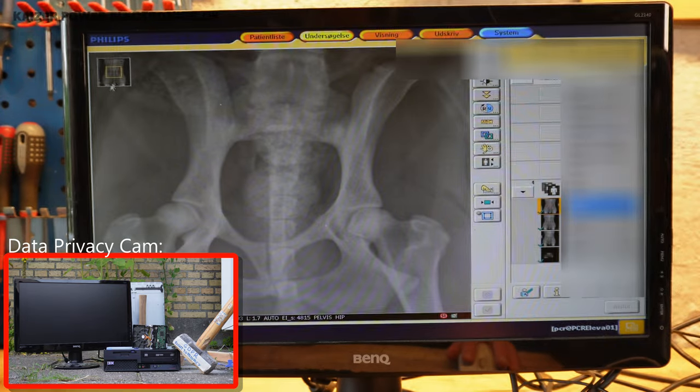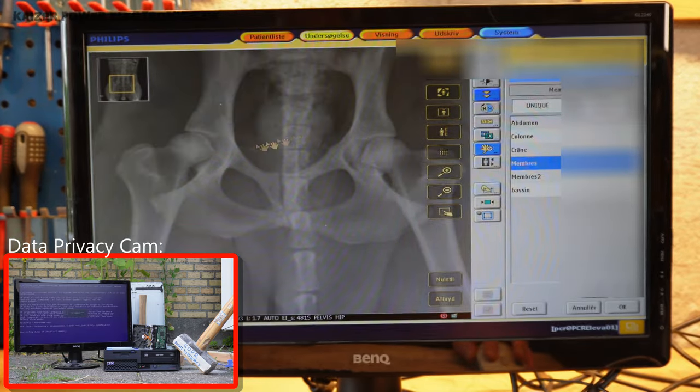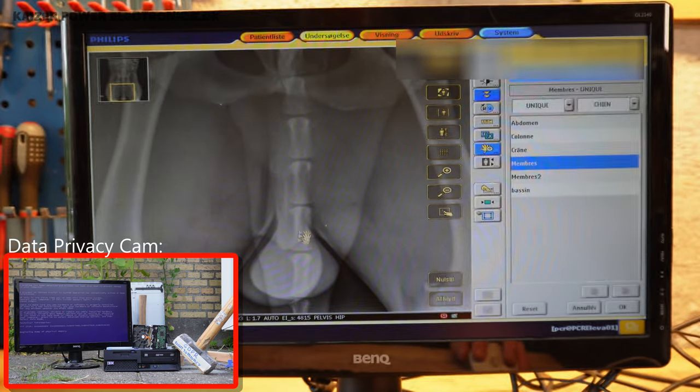Examination. Here we have something like drag and drop. I'm no doctor, but I'm pretty sure this is not a human — it appears to have a tail and testicles.